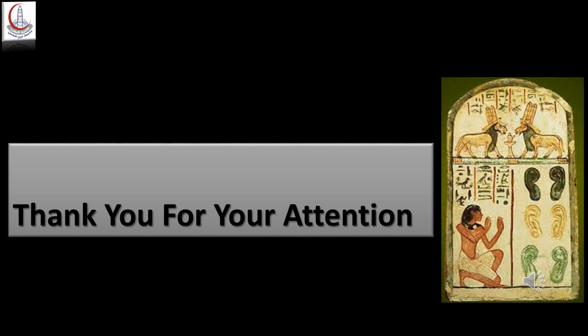This concludes the first part on imaging of cochlear implantation. The next presentation will be about abnormalities which we can face during the radiology of cochlear implants and how these abnormalities and anomalies can influence our decision for cochlear implantation.